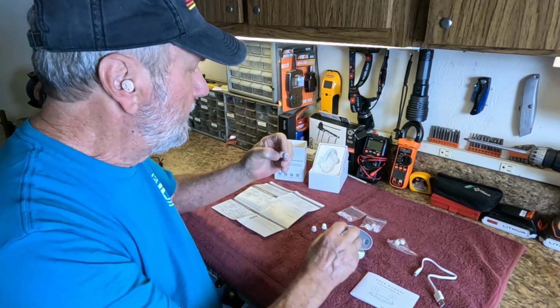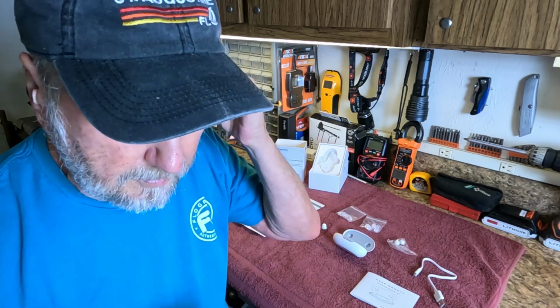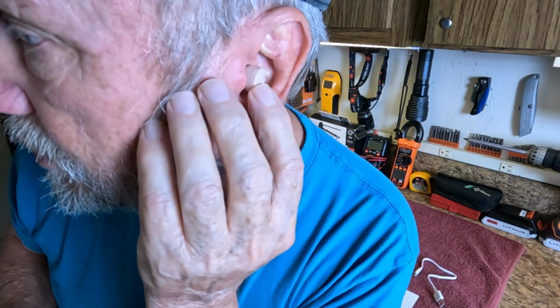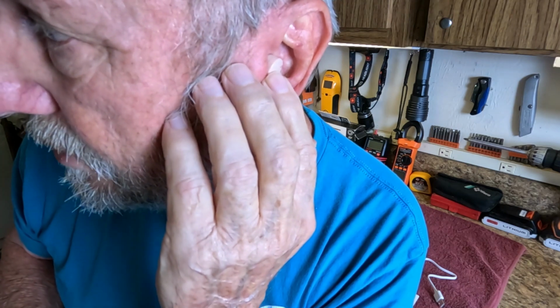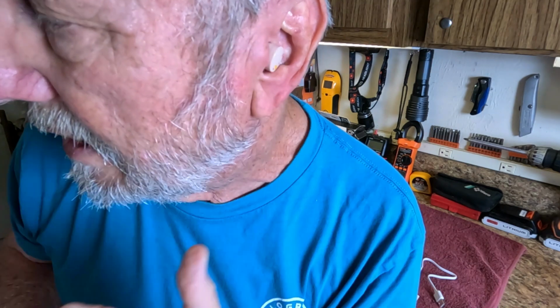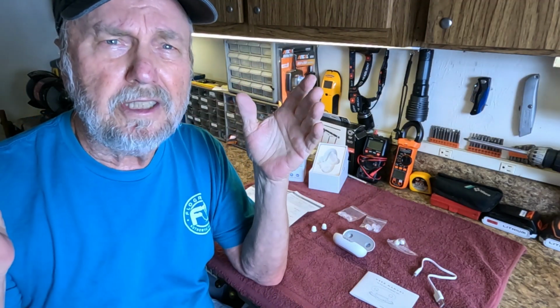Okay, let's put the other one in. Actually, I got it in. I'm going to make sure I got it right. Okay, again, I push it for 3 seconds. 1, 2, 3, and let go. And now 1, 2, 3, 4 beeps. Now, both of them, I hear myself talking really good.